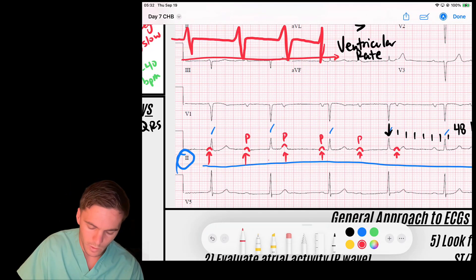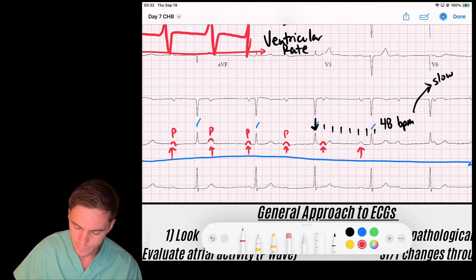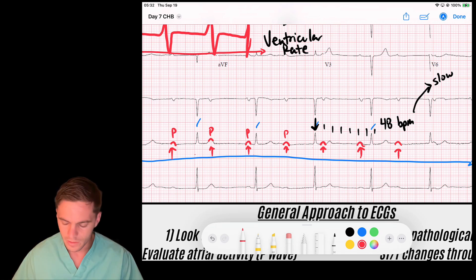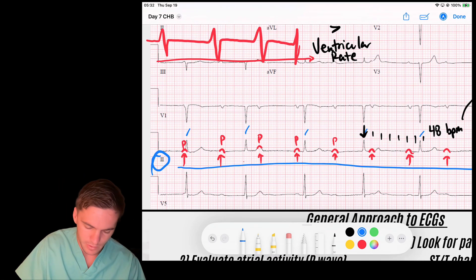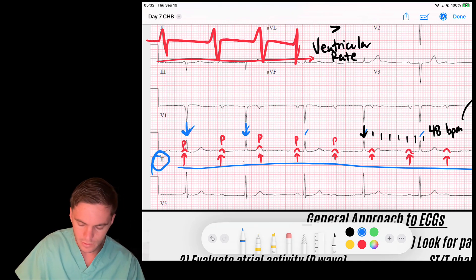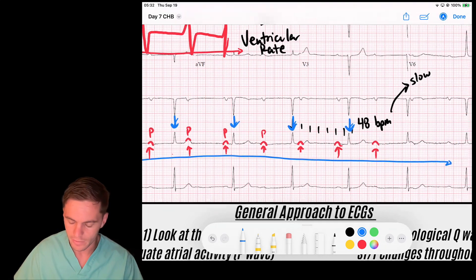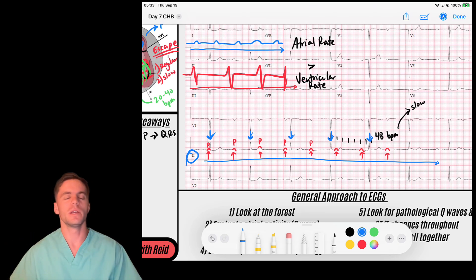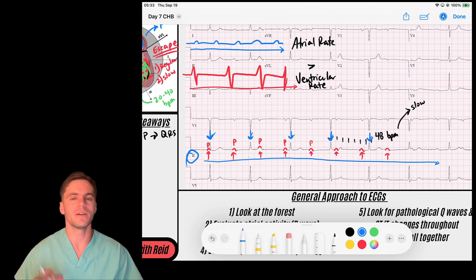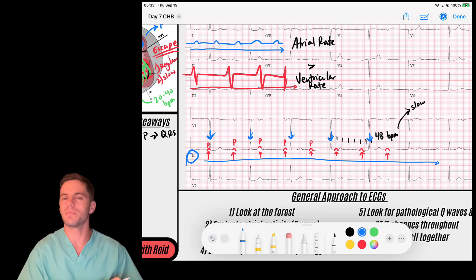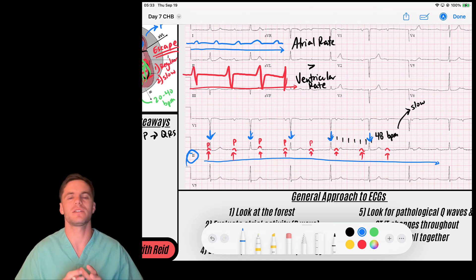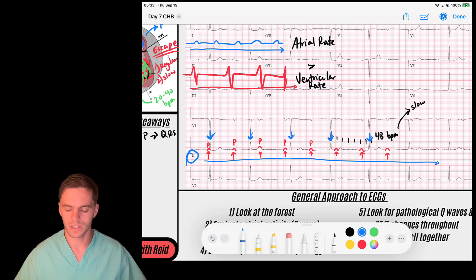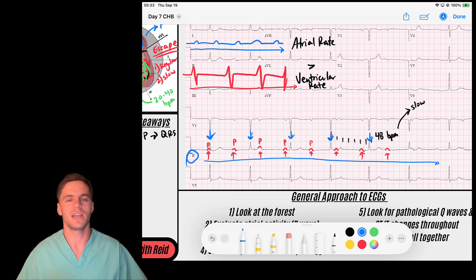The P waves are occurring quite regularly — there's another one, and another one. All P waves are marching through the rhythm. Then looking at the QRS complexes: QRS, QRS, QRS — all occurring at a very regular pattern. When I see P's marching through the rhythm and QRS complexes marching through the rhythm, and the atrial rate is greater than the ventricular rate, that tells me the sinus node and the ventricular escape rhythm are happening completely independent of each other. The AV node is not communicating any signal down to the ventricles.